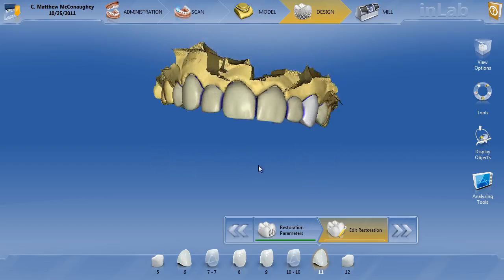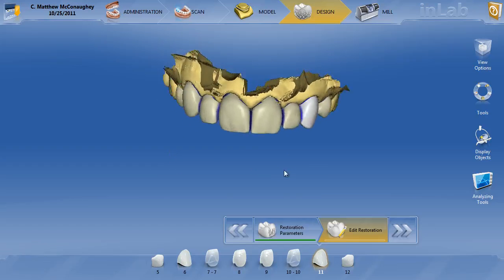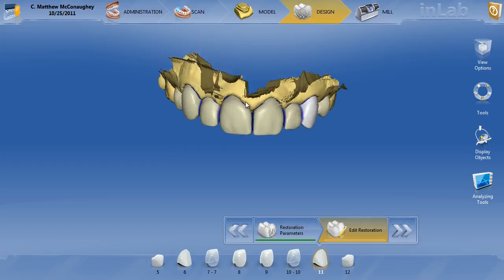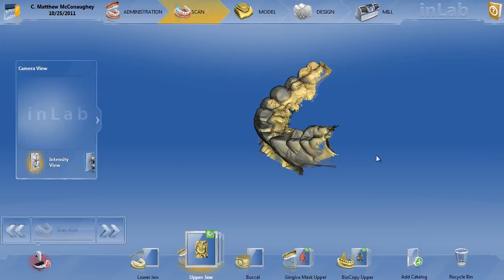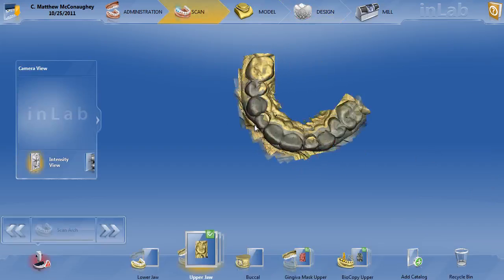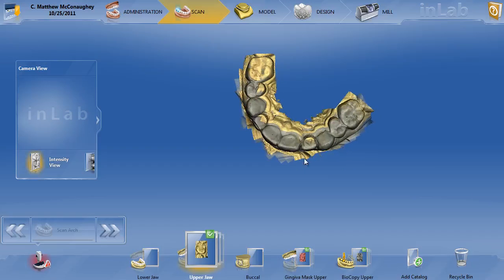This case was very nicely executed in design — he did a diagnostic wax-up, did biocopy, and then went ahead and designed the case based on that. If we go back and look at the scans, you can see exactly what was done here as far as images. You can see that the biocopy or the wax-up is nicely overlaid on that preparation model.